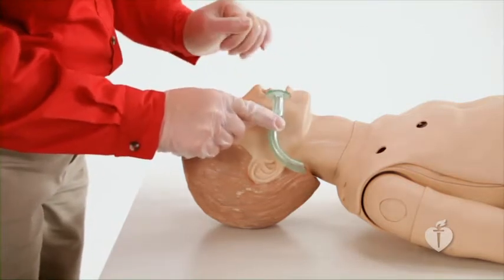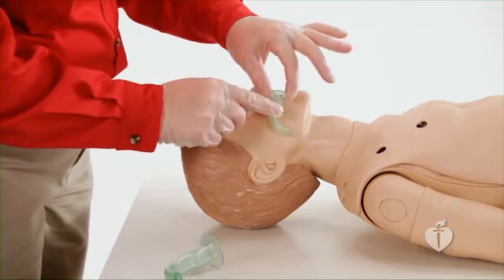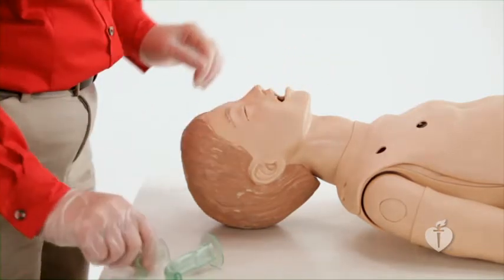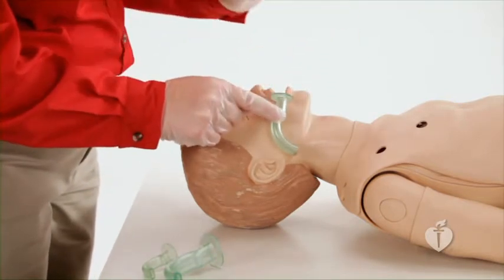If the device is too large, it may block the airway. If it is too small, it can cause the tongue to obstruct the airway. This airway is the correct size for this mannequin.